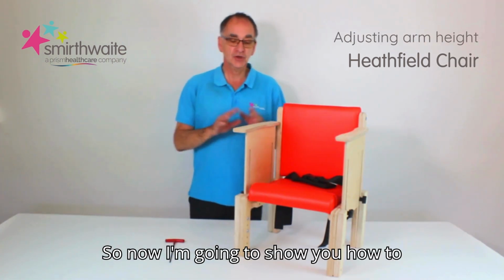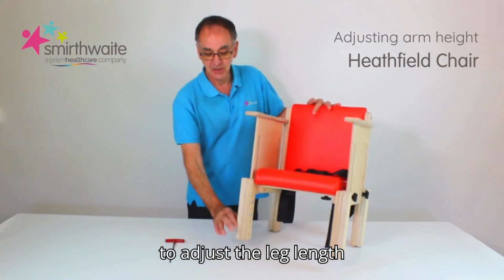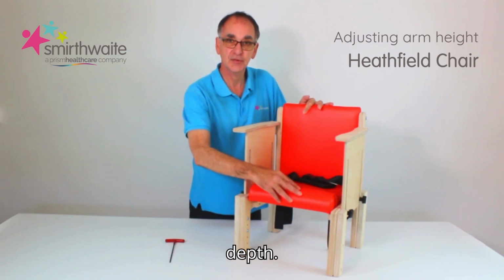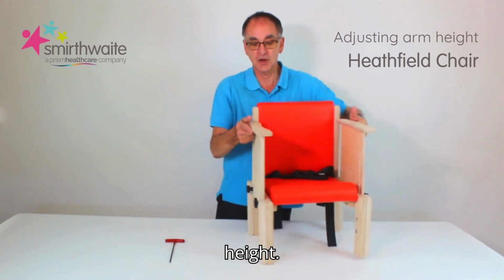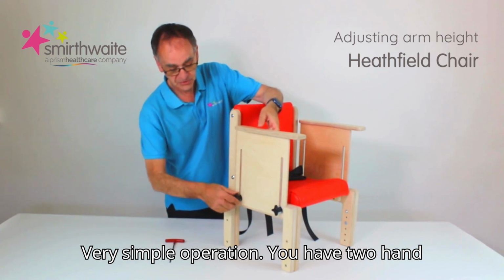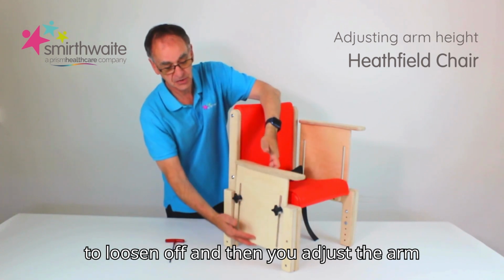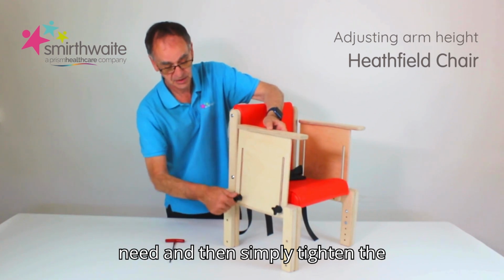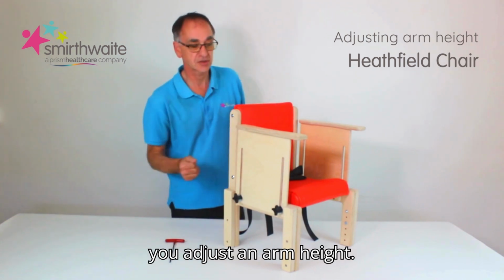So now I'm going to show you how to adjust the arm height, how to adjust the leg length, and also how we can adjust the seat depth. Firstly, the arm height. So a very simple operation. You have two hand wheels on each side, which you just need to loosen off, and then the arm can be adjusted to whatever height you need, and then simply tighten the hand wheels, and that's how you adjust an arm height.